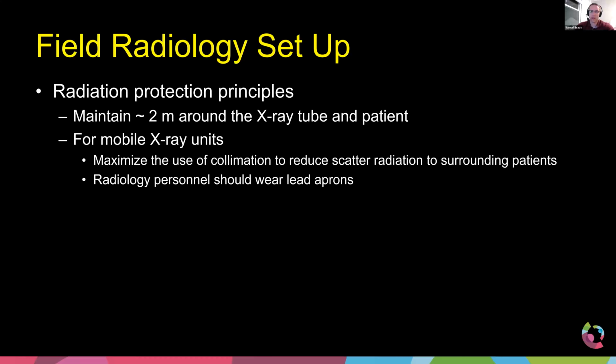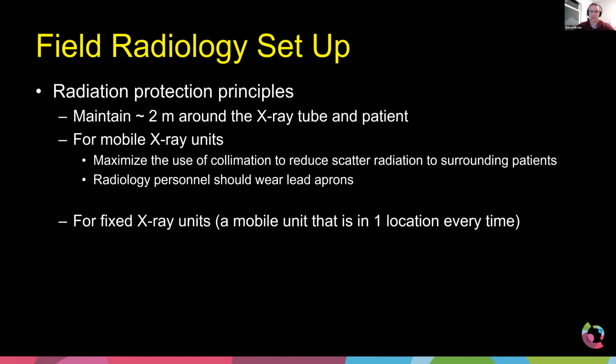So maximize, do your very best to collimate, because the better the collimation, remember, less scatter comes off. Obviously, everyone should wear lead. And then, as I said, if you can get people to step back or do your best, you'll minimize how much scatter will be incident upon everyone around you.